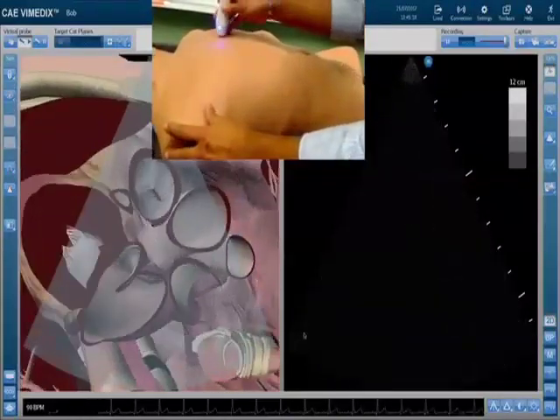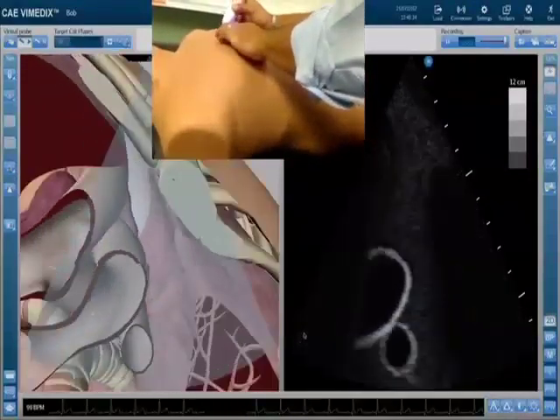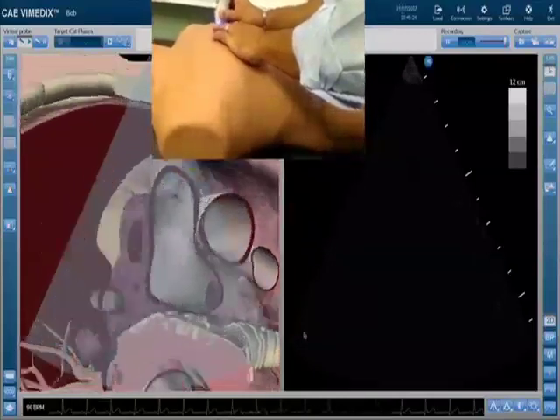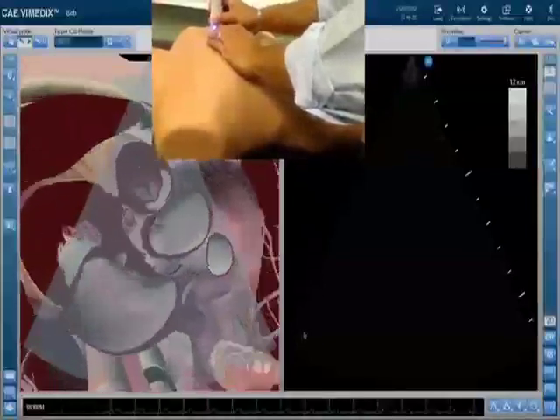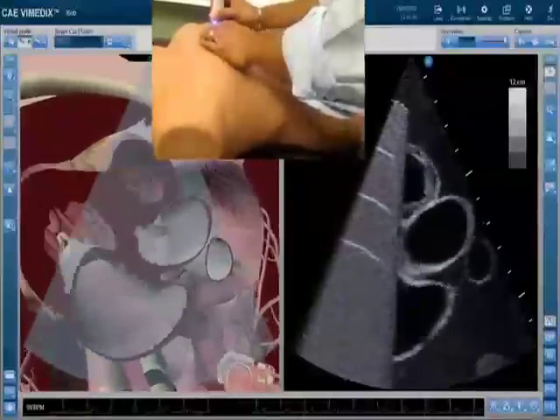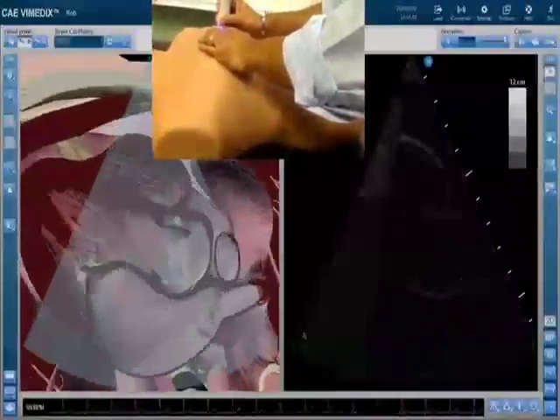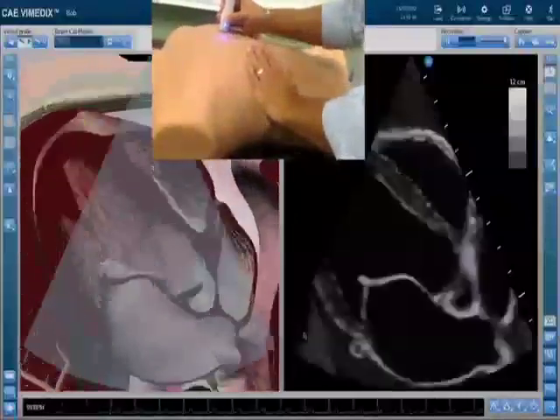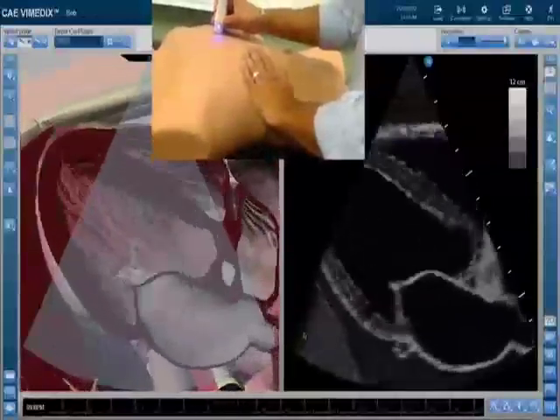shoulder. The key thing about this is that you want the footprint of your ultrasound probe to be resting just as you come off the sternum. Often people start off fairly lateral from the sternum, and I would encourage you to first initially place the probe very much proximal to the sternum. So here we're now placing our probe on that sternum, third or fourth rib space, sliding to the point where I'm in between rib space, trying to avoid that lung parenchyma to evaluate the cardiac structures that we're trying to see here. And so here's an ideal parasternal long axis view.